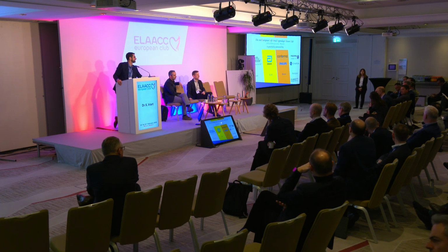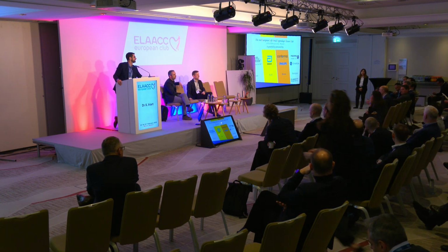That's true. I have many thoughts about what we are discussing. First of all, if you do a TEE before, even a 3D TEE, for pre-planning, you can anticipate some complex anatomies that can drive your choice of device. Most cases are relatively simple and you can tackle them during the case even without knowing the anatomy. The thing is that when you go in the lab and you don't anticipate a very complex case, like a retroflexed chicken wing with short depth, and you discover that during the procedure. If you have that information beforehand, I think it's helpful because you know, okay, I will maybe choose this device, I will go for this size, so you increase the efficiency.